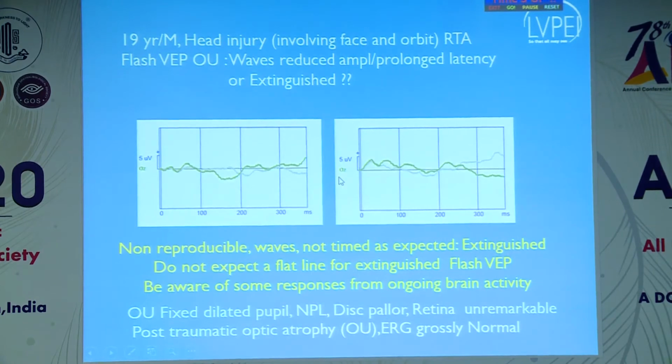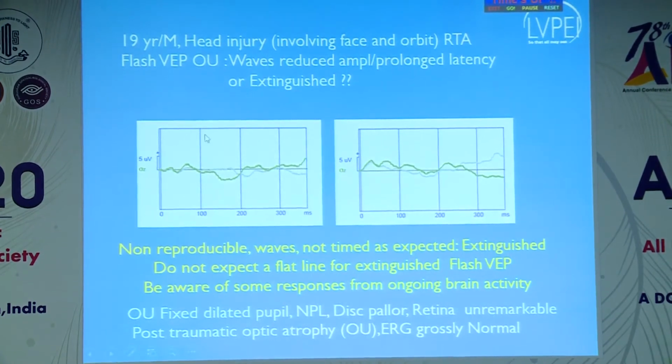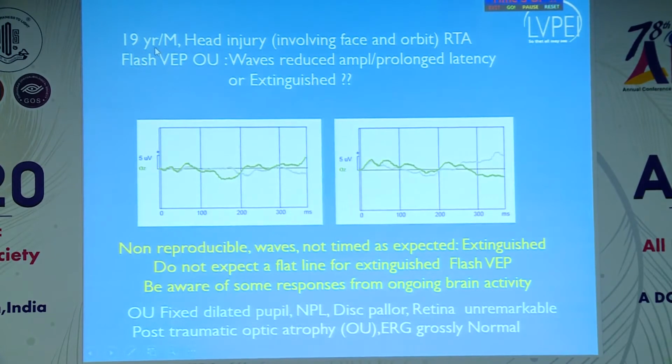Finally, we can see a representative case: a 19-year-old male with head injury, no light perception. There are some responses here, but actually they are not reproducible. They are not the way we expect. These are just noises, not actual responses.